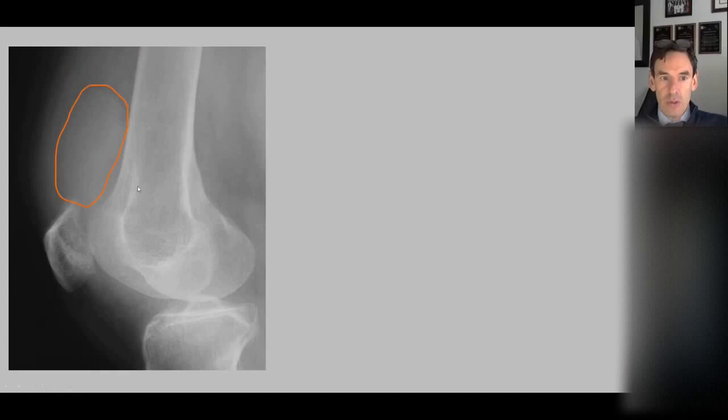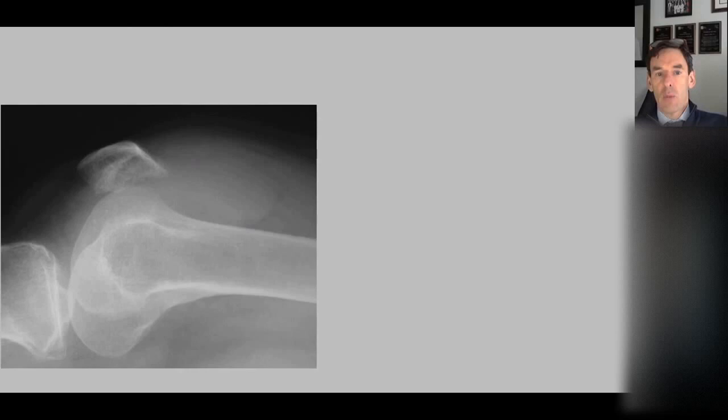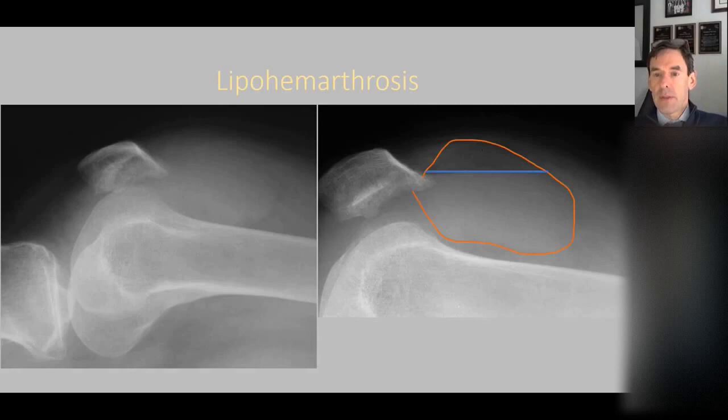In some knees with a large joint effusion, if we lay the patient down and wait a while, that effusion layers out. There's the effusion, but there's a line across it separating fat on top and fluid on the bottom — this is a lipohemarthrosis, indicating there's a fracture somewhere. In this patient, because of the irregularity, it was probably a dislocation of the patella with a small fracture. You often have to lay somebody down for a few minutes before it layers out.